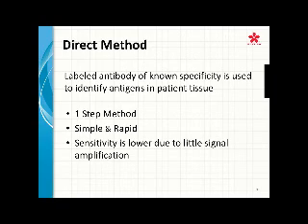And it's labeled with fluorescence at the end that's usually viewed by a fluorescent microscope. So I want to take a look at a model, like a structure of a direct method.